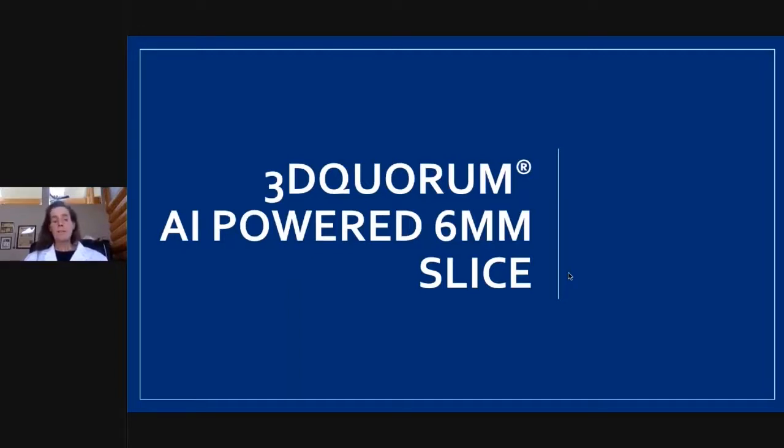Now, I will say our transition from the combo mode to the C view was a little bit slower. We were a little bit uncomfortable. We weren't sure. We were like, are we going to be missing things? Do we not feel like we need a true 2D, full field digital image? And so for a while, we did do the combination mode for our screening patients.